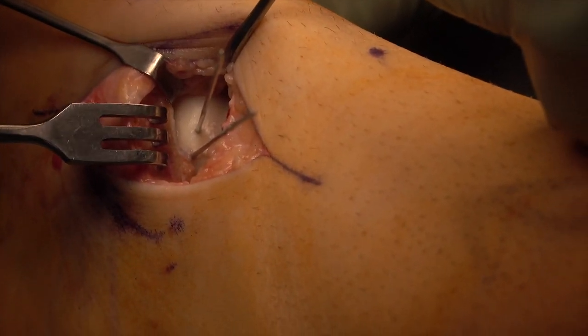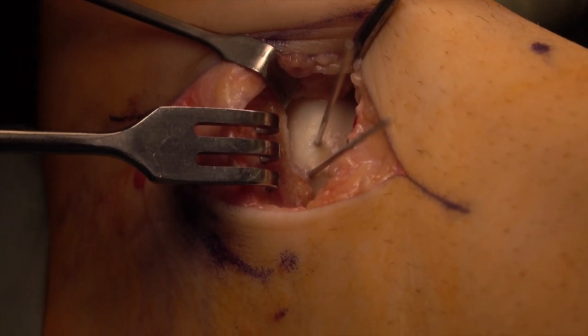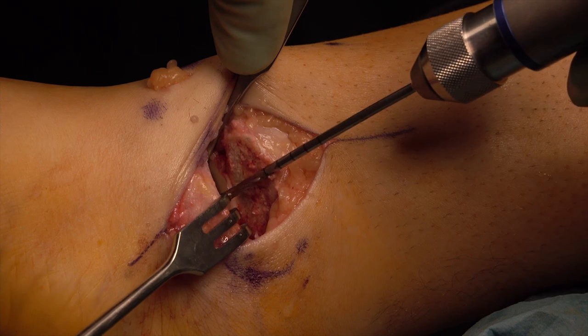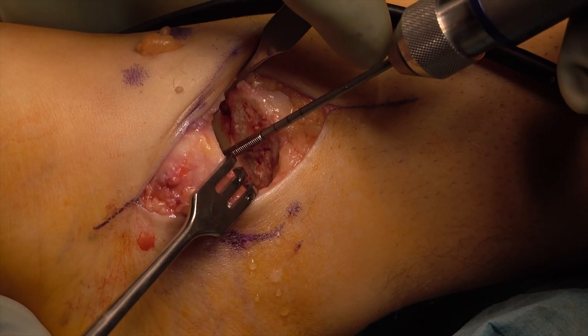Two 1.2 mm thick guide wires are now inserted centrally into the lesion. Using the cannulated blue drill, we drill along the two wires and then thread the hole for the 3.5 mm shark screw with the blue thread cutter.